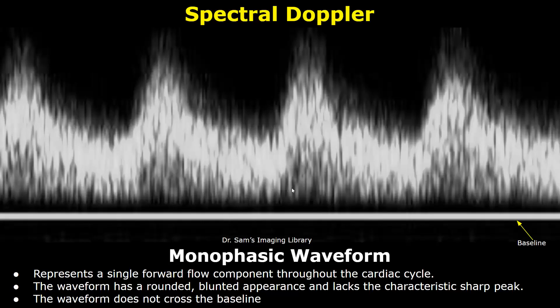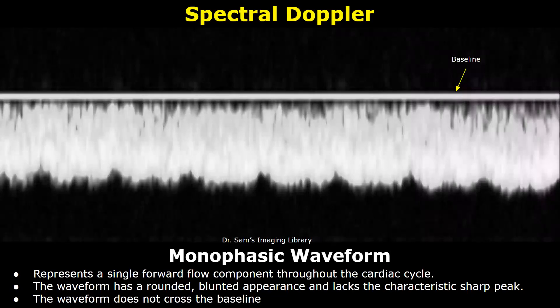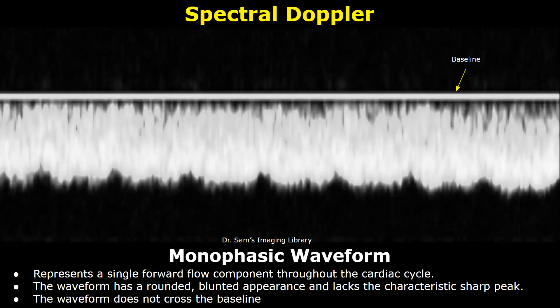Here is another example of a monophasic waveform. We only see one component, that is of forward flow, and the waveform does not really cross the baseline. There is zero diastolic flow — only one component is seen, that is of forward flow. The waveform is seen at only one side of the baseline, and no sharp peaks are seen within the waveform.